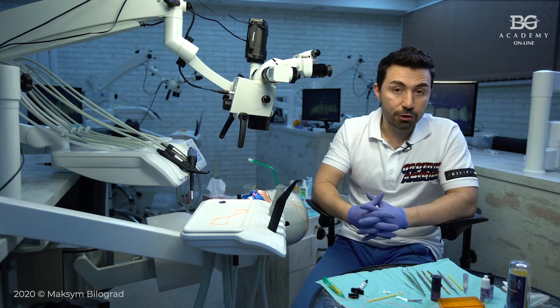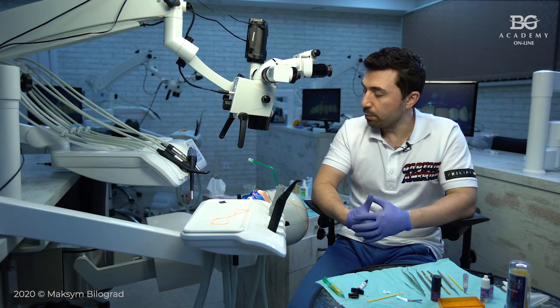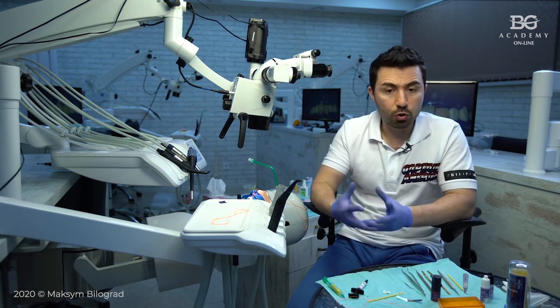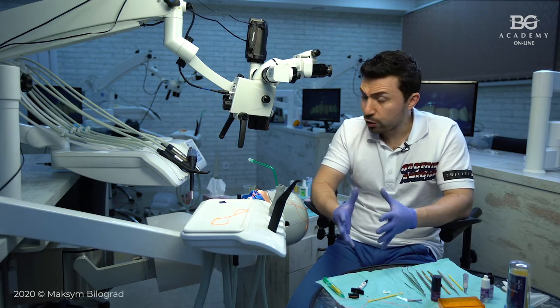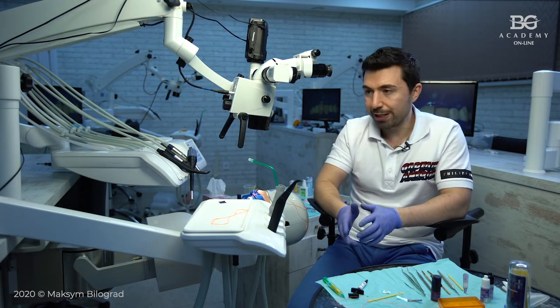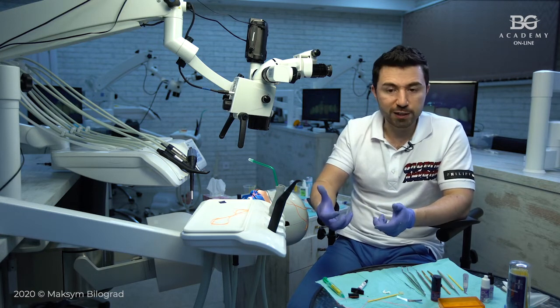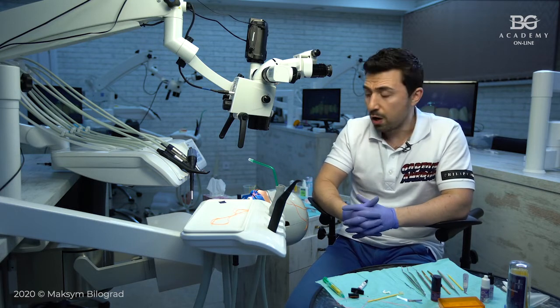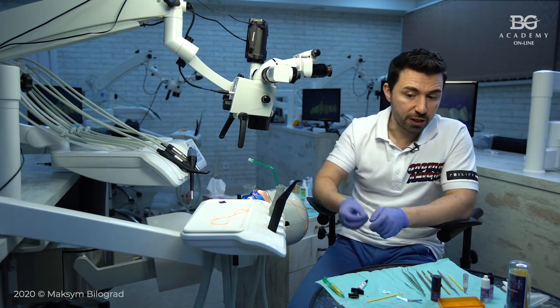Or some clinicians really like to work with a heated paste composite. They heat the composite up to 50 degrees, and then they bond their veneers with normal packable preheated composite. Personally, I don't like this option, because when you play with fitting your composite, even though it is heated, the temperature goes down really fast, and you have to apply more force just to stabilize or fit your veneer on the surface. And if you apply too much force and your veneer is really thin, you can break it.